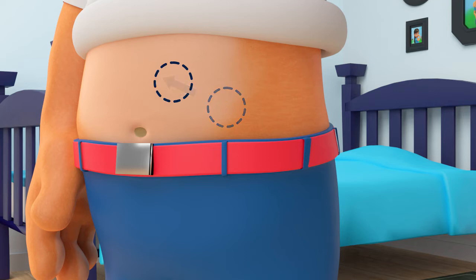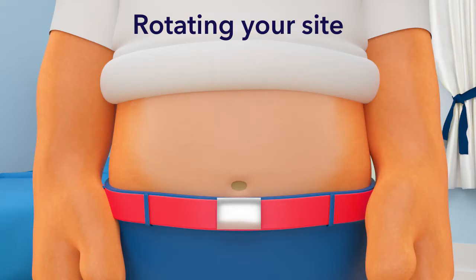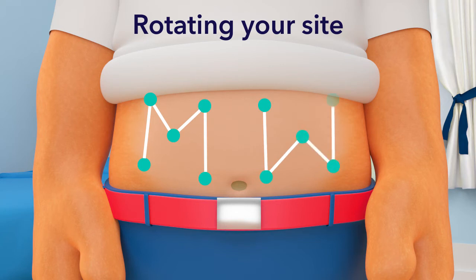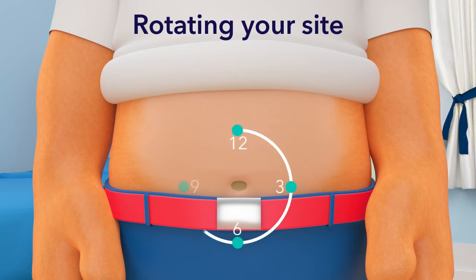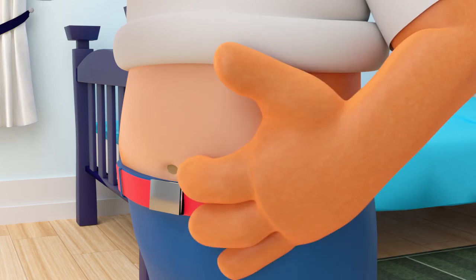The old set was here, so the new set can be here. We call this rotating your site. There are other ways you can rotate your site — for example, you can rotate your site in an M or W shape like this, or rotate like you're going around the clock like this.